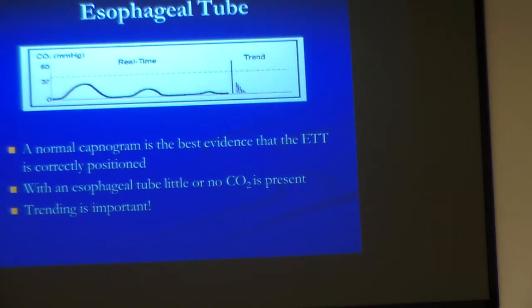If your paper gets some snagginess and isn't coming out, you want to. That never happens, does it? But even if that's the case, every time you hit that snapshot, it's going to be recorded in memory, so you can print it later.